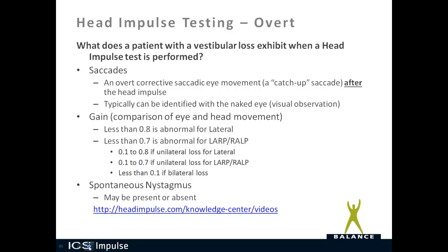An overt catch-up saccade is a corrective saccadic eye movement that occurs after the head impulse stops. The patient should be looking straight ahead at the fixation dot; the eyes go with the head, and when the head impulse stops the eyes move back to the fixation dot — that's an overt catch-up saccade, typically identified with the naked eye. If the patient has overt catch-up saccades, the gain is typically less than 0.8 for lateral and less than 0.7 for LARP and RALP.